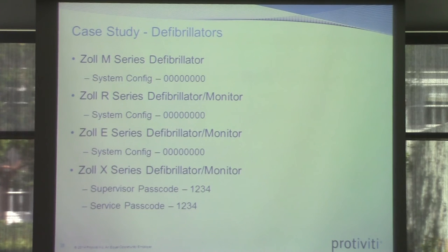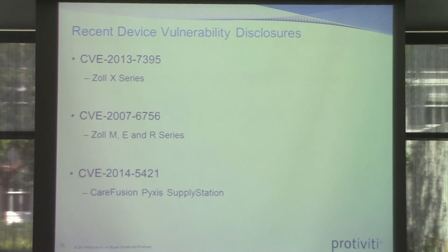Here's the rest of the product line. These are default and hard-coded credentials for pretty much all of their latest external defibrillator monitors. Repudiation. What's that? Just repudiation. Yeah, absolutely. So here are the CVEs that were released. Those top two are what I just showed you. This bottom one was done by Billy Rios. I've actually worked with these devices as well.